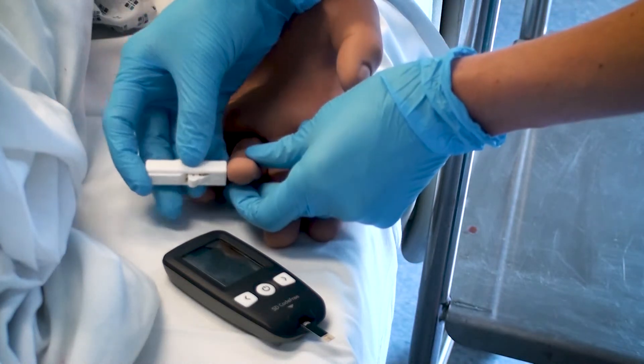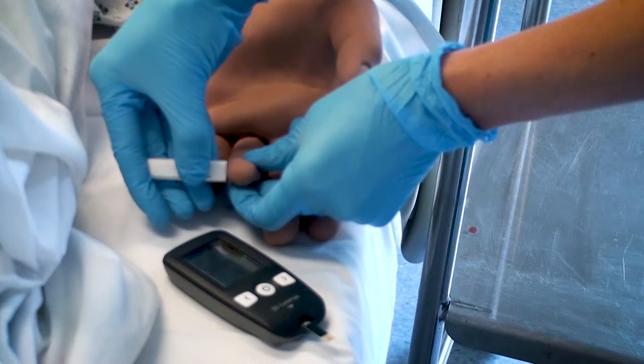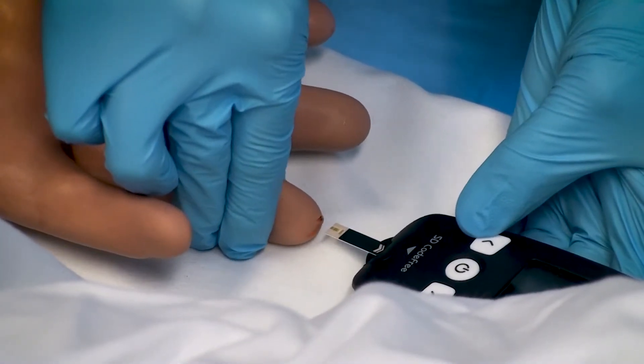Hold the side of the thumb or finger firmly, release the needle and apply gentle pressure to the digit to obtain a sufficient drop of blood.